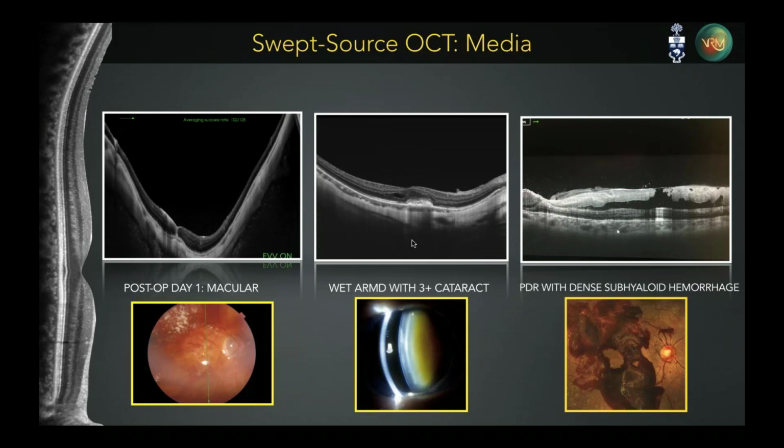One of the advantages, again, is that the Triton does color photography, so you can have a registered OCT to a colored fundus image. So you can confirm that what you saw clinically is actually what you're seeing on the OCT. This patient had a 95% gas bubble in the eye, and we were able to image through the bubble in its entirety. We actually published a series of 35 eyes with macular hole surgery on post-op day 1 and post-op day 3, even showing excellent penetration and capturing of the macular hole status. So gas, no problem.